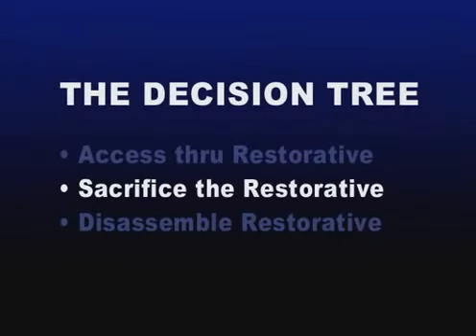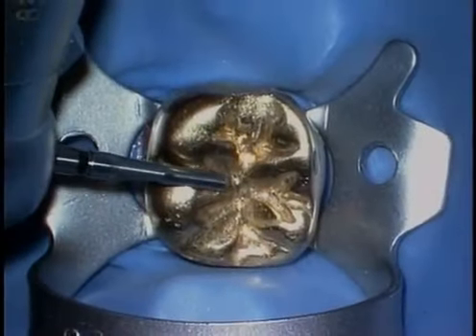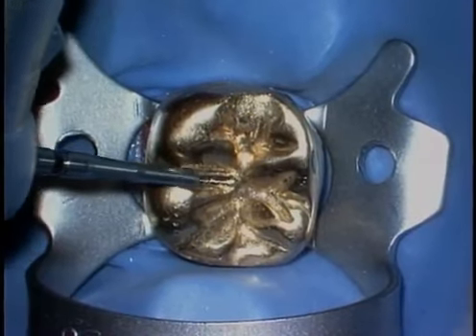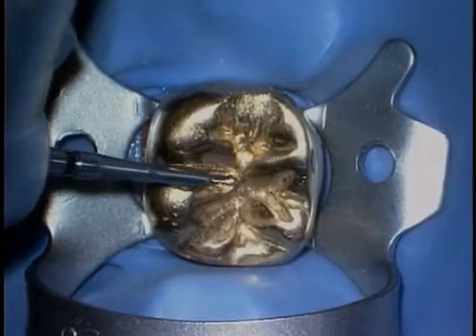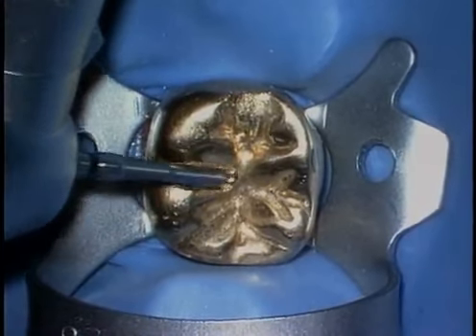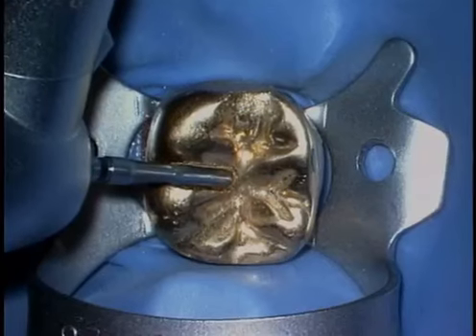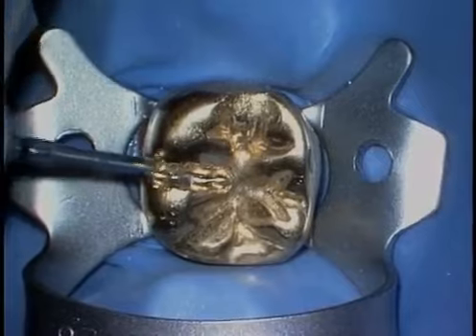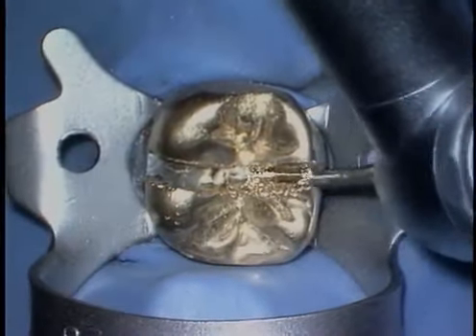Depending on clinical circumstances, inlays, onlays, crowns, bridges, splints, copings, and superstructures are sacrificed and removed by sectioning with a transmetal cutting burr. In some instances, if we need to have better access into pulp chambers, crowns have to be sacrificed. A transmetal cutting burr can be laid over on its side and can begin to section the crown from the central pit area out to the buccal surface.